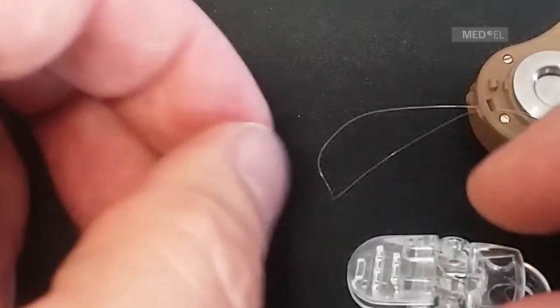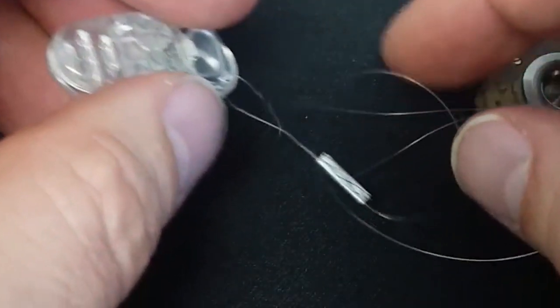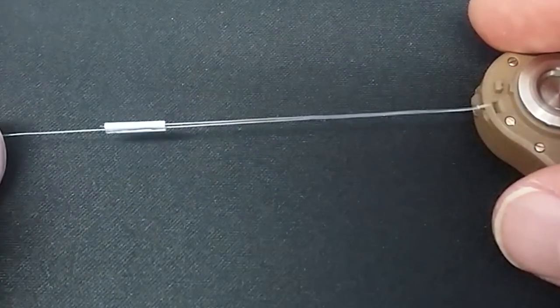The retention clip can be connected to the audio processor with a loop. It is recommended during sport, play, or in other situations where there is a risk of the device falling off. The clip can be attached to clothing.